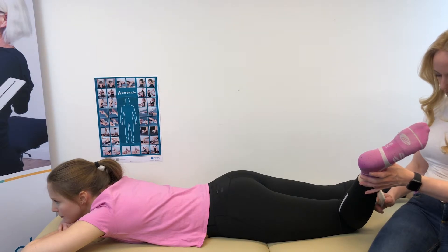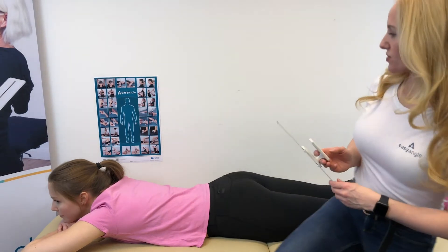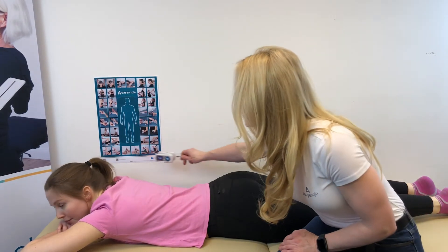We press the button again and we get the measurement. This is also demonstrated in the poster down here on the bottom left.